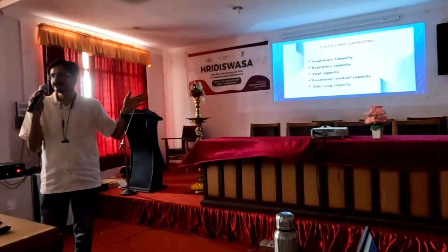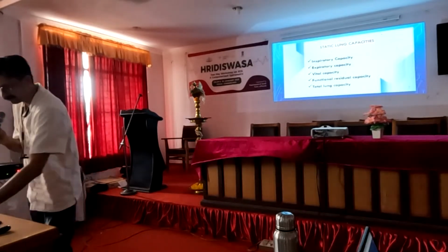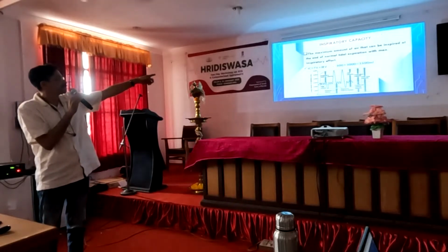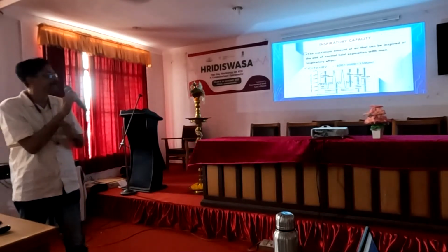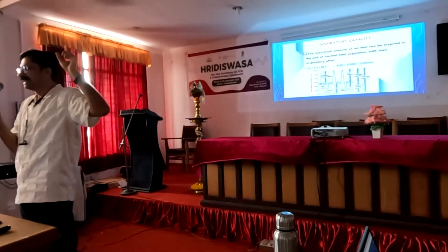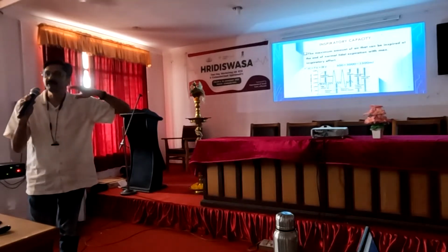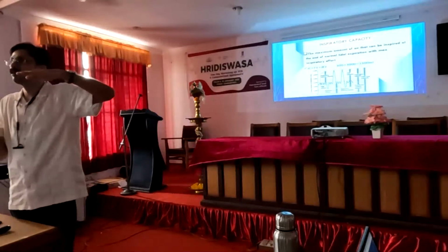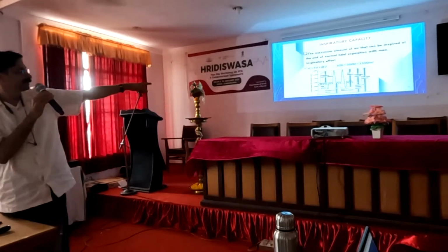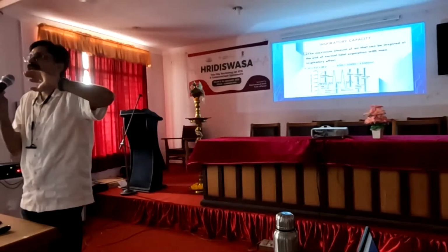Static lung capacities are the combination of two or more lung volumes that we can see. First, we will look into inspiratory capacity: the maximum amount of air that can be inspired at the end of normal tidal expiration. Don't confuse this. Inspiratory capacity is the maximum amount of air that can be inspired at the end of normal tidal expiration. Clear? In the picture we can see the normal tidal expiration and the maximum volume of air that can be inspired.